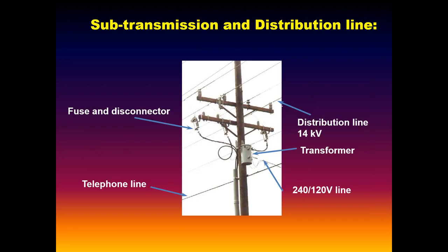All right. A little bit about how this electrical power comes into not only our hospitals, but our homes as well. You've probably seen some of these, depending on where you're living. The voltage is coming in through a transformer. They call these pole pigs, a big garbage can hanging on the pole. Typically in residential areas, that incoming voltage will be right around 14,000 volts. That's the top wire on the pole there. And then that 14,000 is stepped down to typically 220 or 240 volts AC. There's a center tap in that transformer that allows us to get our 120 for our outputs.